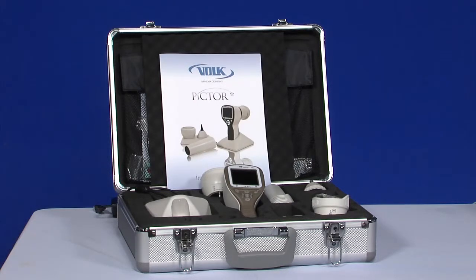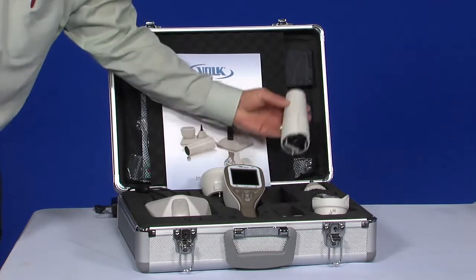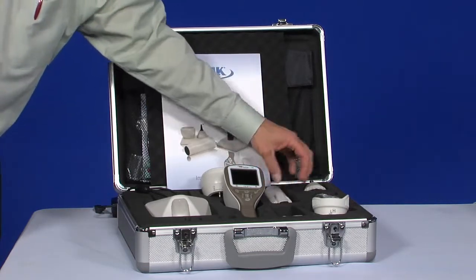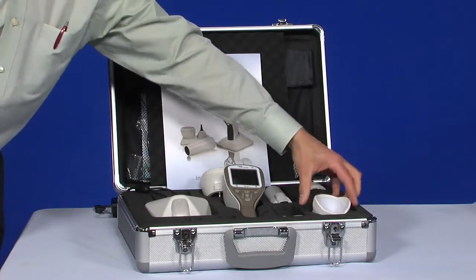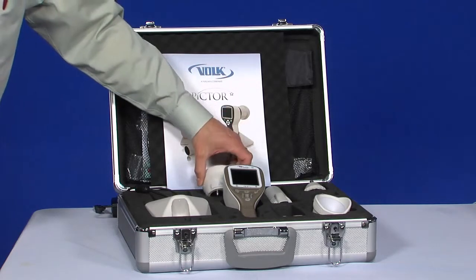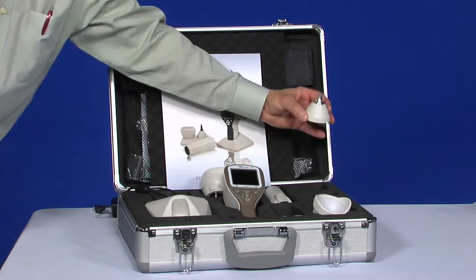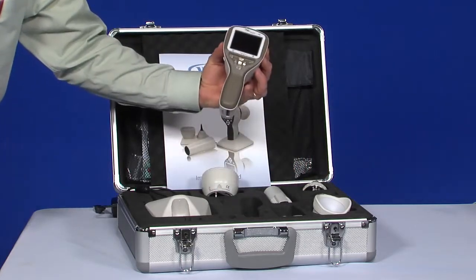The supported optics modules and their intended uses are as follows: a module for fundus imaging, a module for exterior ophthalmic imaging, a module for dermatoscopic imaging, a module for otoscopic imaging, and the handset for general imaging.